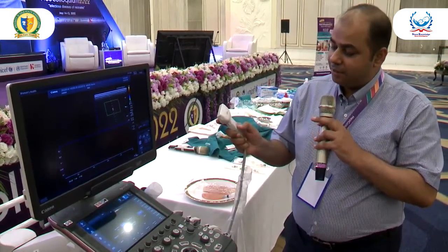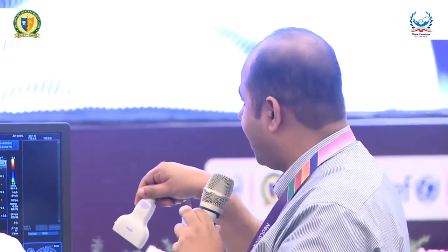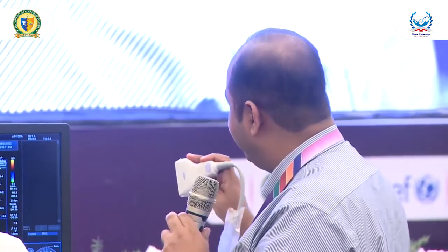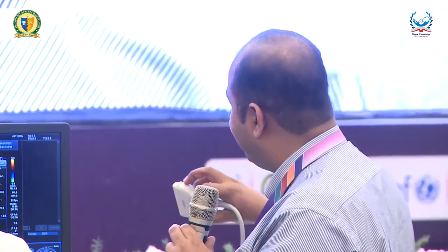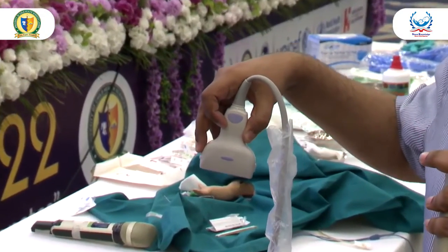This is the marker which should be placed towards you whenever you are holding this probe. Just like you hold a pencil, you hold this probe with your right hand, marker pointing towards you, and the other marker which I showed you pointing towards the head of the patient.